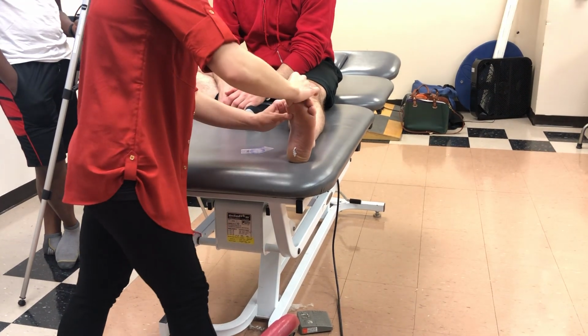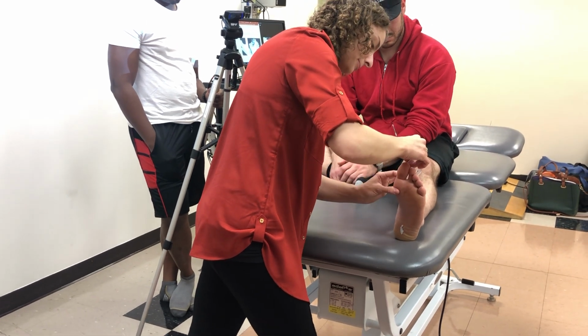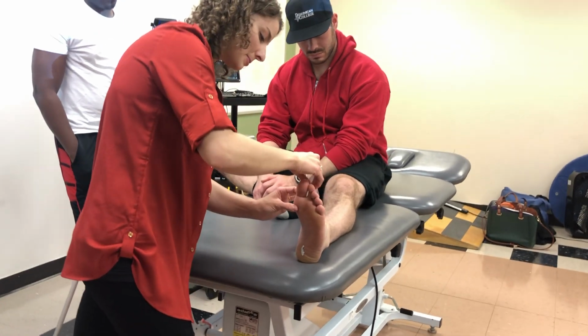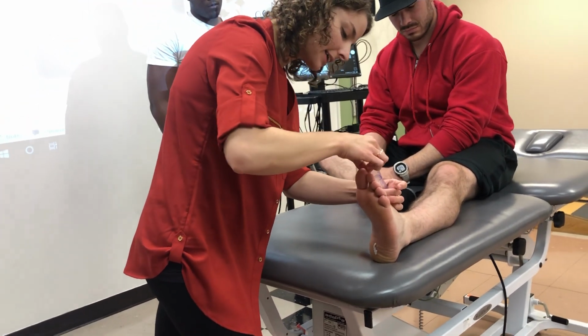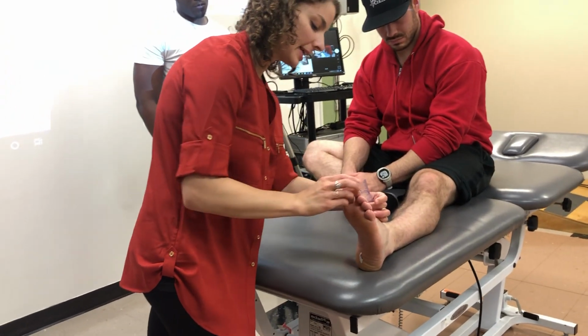So then from there, with your goniometer, you can take the fulcrum and put it on the dorsum of the actual joint, the MTP joint. Align it with that first metatarsal. So midline of the first metatarsal and midline of the proximal phalanx.